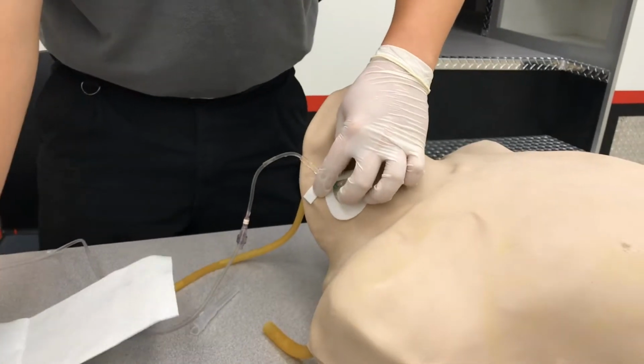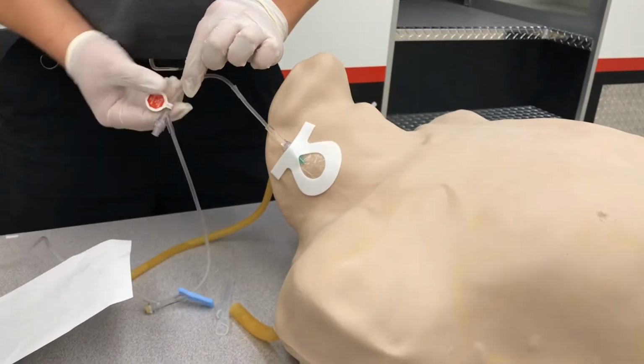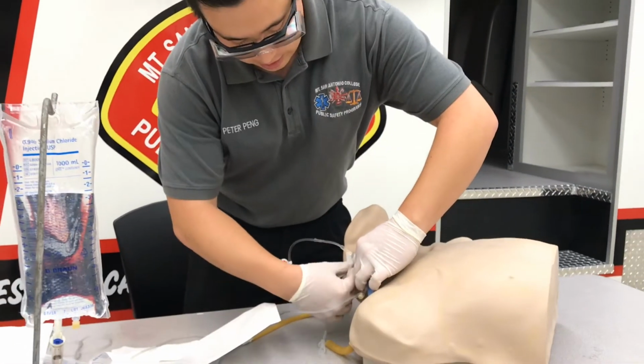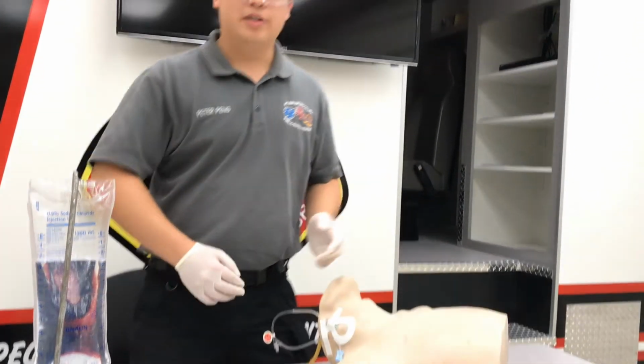Now when you're securing this, you want to wrap this part around the patient's ear. That way you've secured it, and you also have access to this port if necessary. So that'll go around the ear, and then we will tape it again back here at the base of the neck. Now reassess the patient and you're all set.